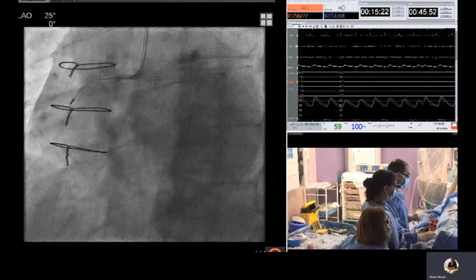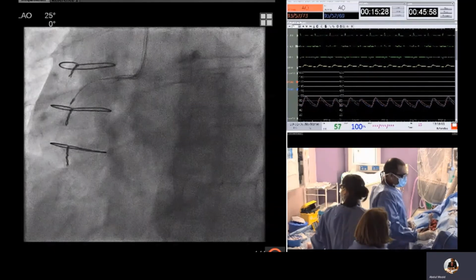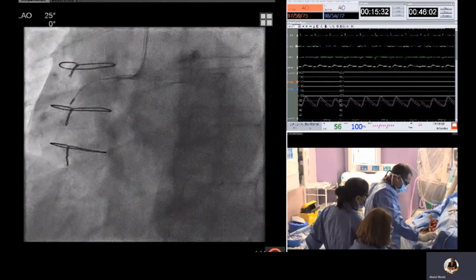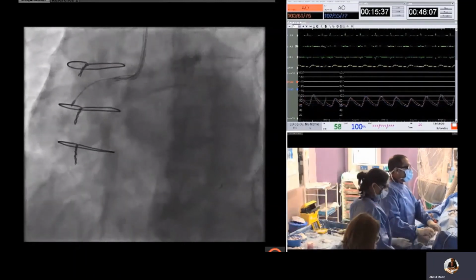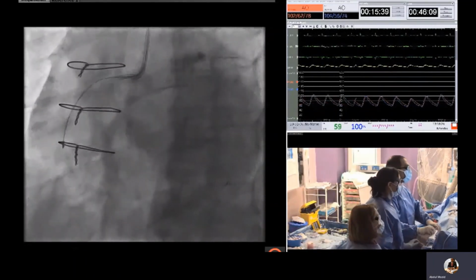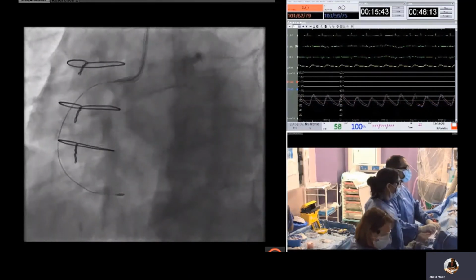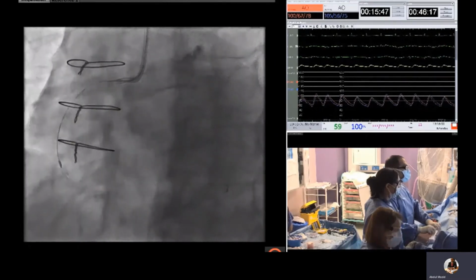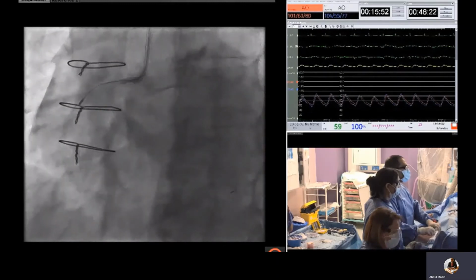We gave 600 micrograms of atropine at this stage. As is our routine practice, we do not use temporary wires routinely, as any heart block is usually short-lived, and actually giving some atropine up front prevents that from happening. So this is following atropine. You can see easy passage of the burr in the proximal to mid to distal RCA.